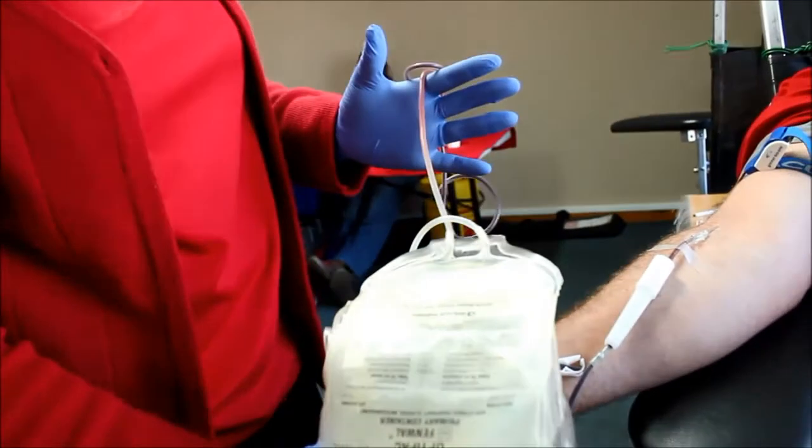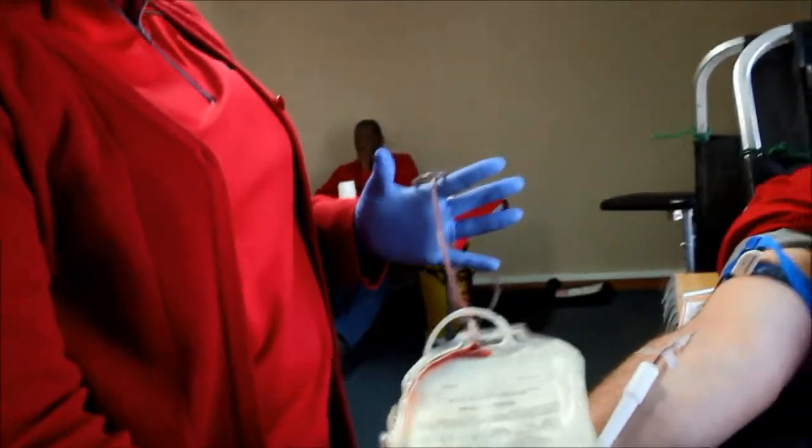This is the pouch where I'll collect the small samples from him. This is where the blood goes — it's 500 mls.